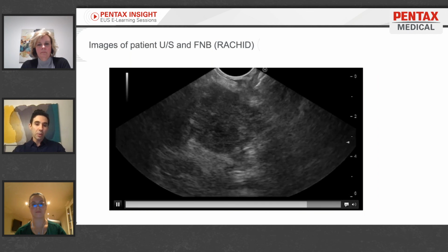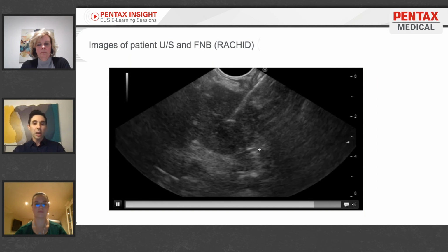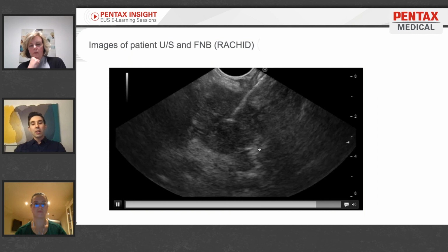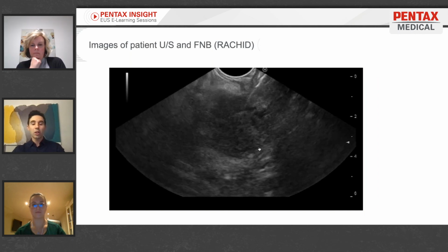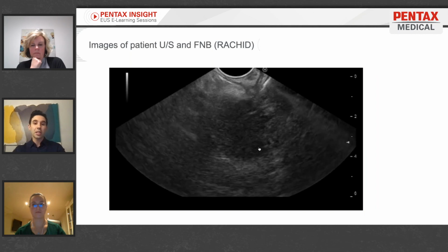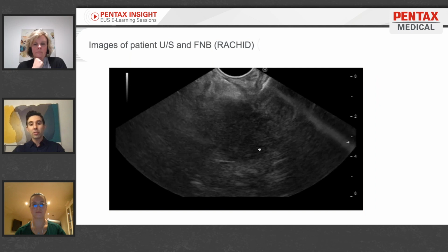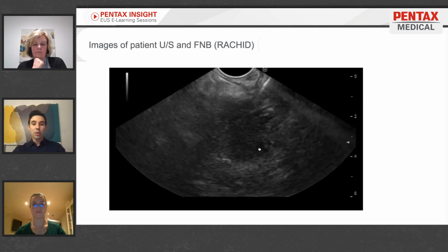We've already checked to make sure there are no major blood vessels in this area. And then we puncture the tumor. Our nurse is usually applying some negative traction with the stylet, or applying some suction, or taking it out entirely. And we're just passing our needle back and forth through the tumor, fanning across different sections of the tumor, and retrieving cells into the needle.